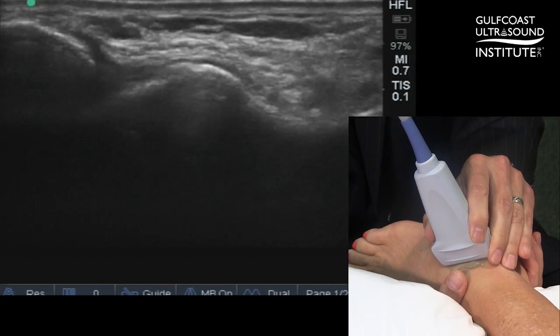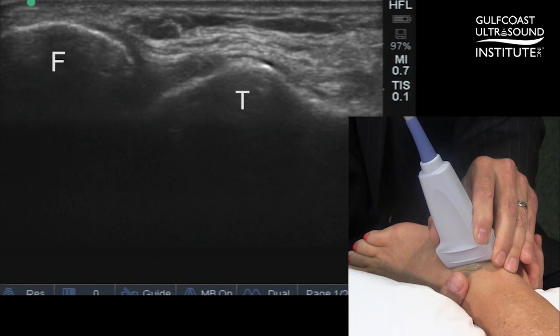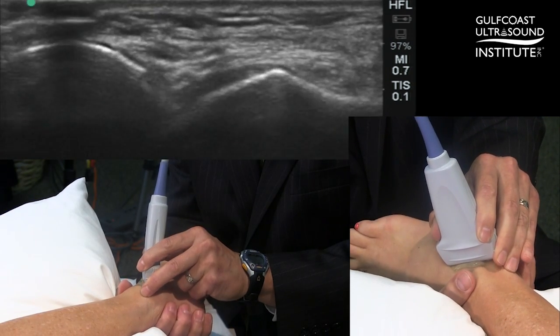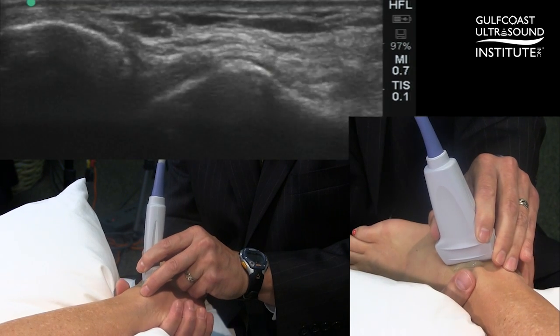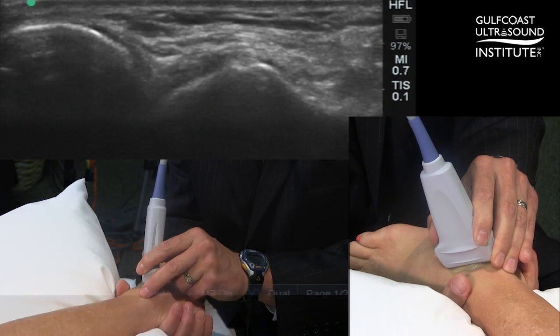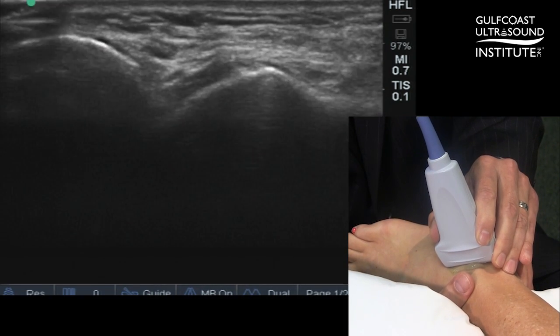We simply keep the two bones in view — the distal fibula and the talus — while performing the stress test, maintaining pressure on the thumb and the front of the tibia while pulling the calcaneus and the talus anteriorly and into slight inversion.